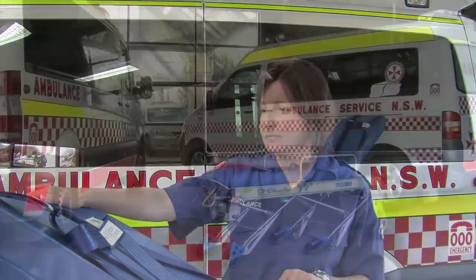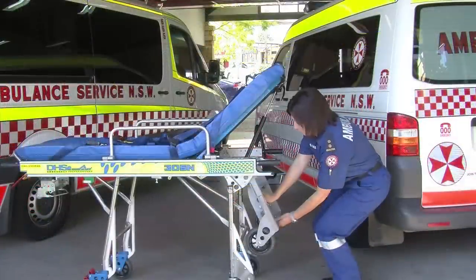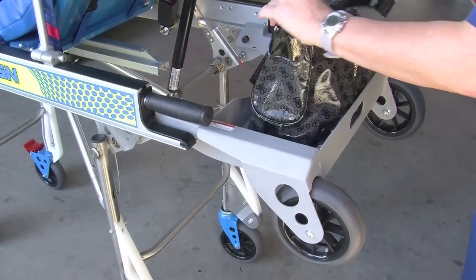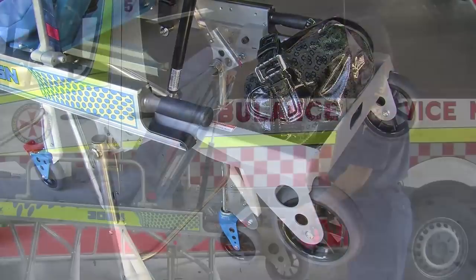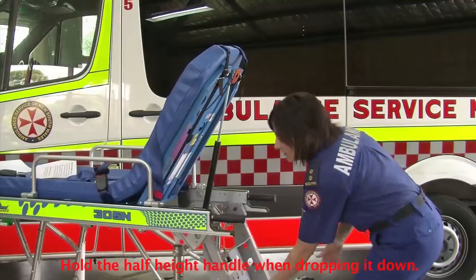The major difference you will notice is at the front end of the stretcher. The new half height also acts as a reduced length loading unit and personal effects tray. Take the weight with the handle, release the pin, and lower the tray.